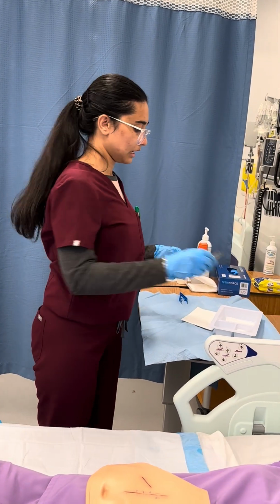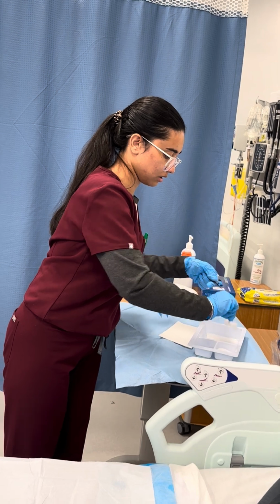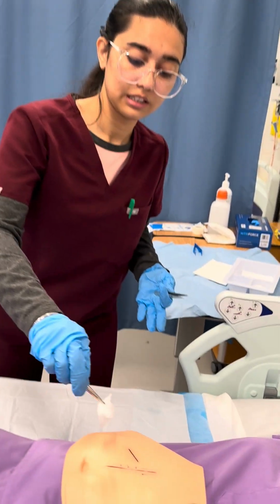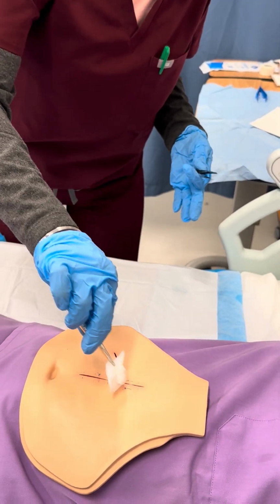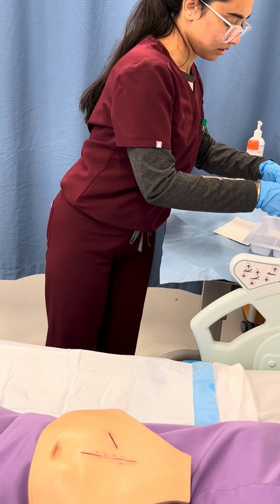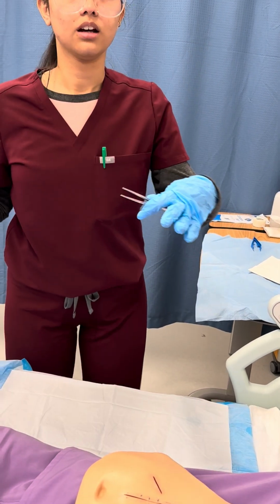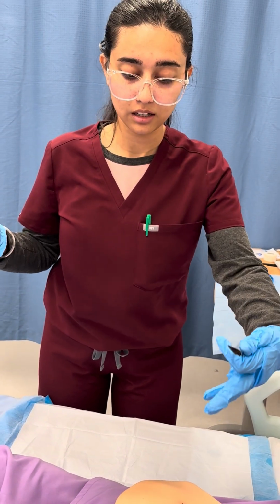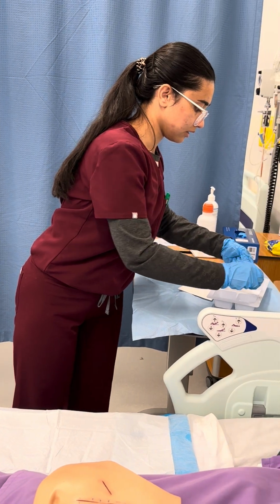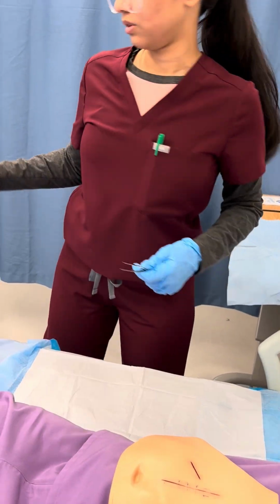Now after cleaning the wound with normal saline, I'm going to pat dry, taking a gauze. So same technique, least contaminated area to most contaminated area for pat drying. So the least contaminated area is the suture line. I'm going to pat dry it head to toe in one stroke, discard, taking another gauze piece, then I'm going to clean the area that is away from me, pat drying in one stroke, head to toe, taking another dry gauze, cleaning the area that is towards me, head to toe in one stroke and discarding it.